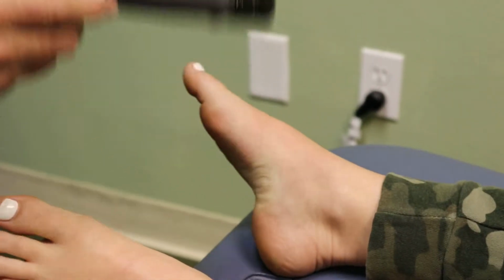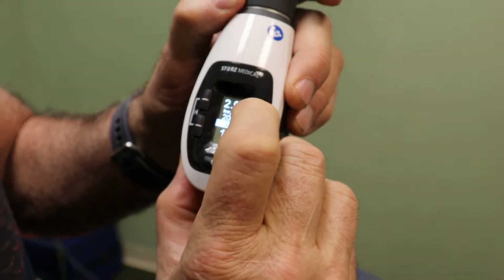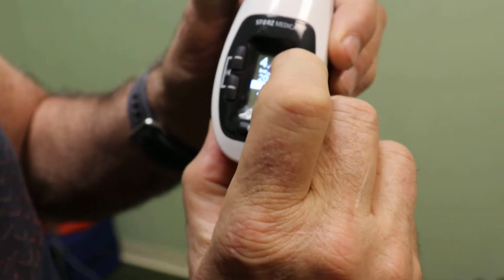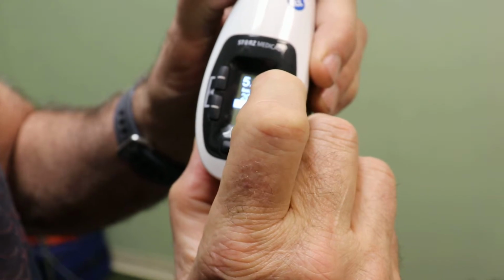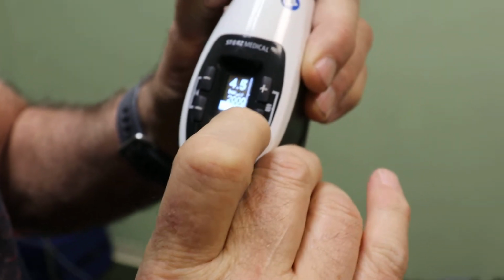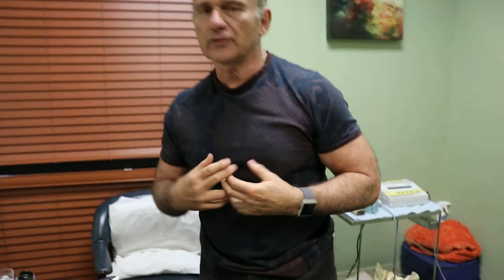We can adjust, if we look at this handpiece, here is 2.5, that's the bar it's called, and we can increase that, as you see, up to 5 bar, which is the deepest penetration of that tissue. We can also look at the hertz. I can adjust that. Okay, and so this has been an amazing tool for us to help heal tissue in the clinic with a lot of our patients. They come back for more and more visits because they see changes.